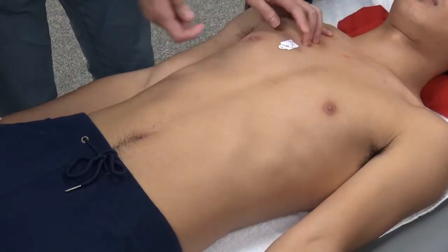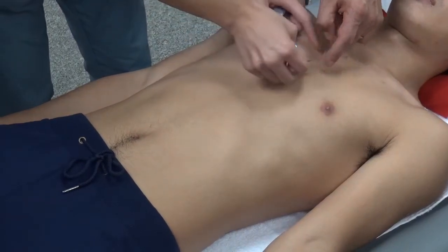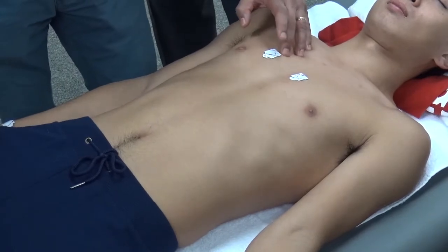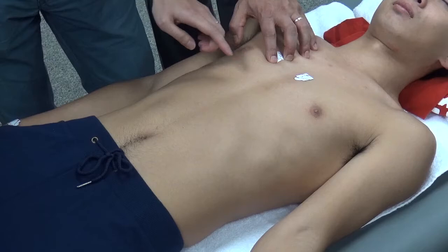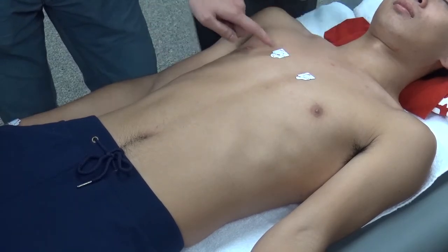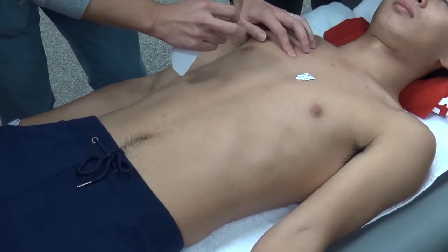Okay? And then just off the centre. Don't go too far away. Just either side, yeah? Three. It's actually lower. It's 1, 2, 3, 4 is actually there. So you're actually at 3.5, it's actually lower, in the space between them.